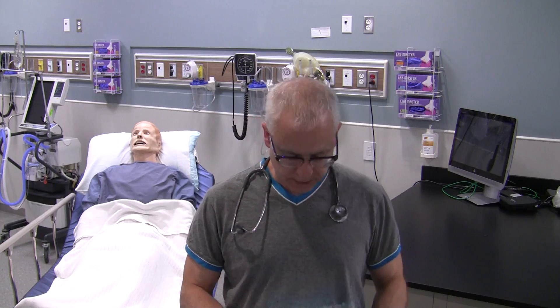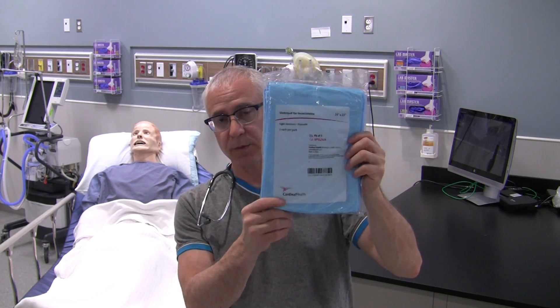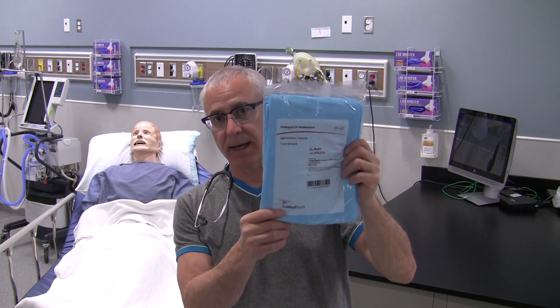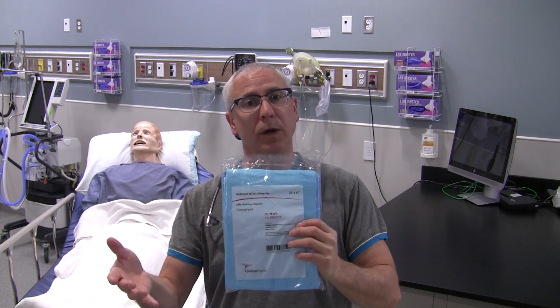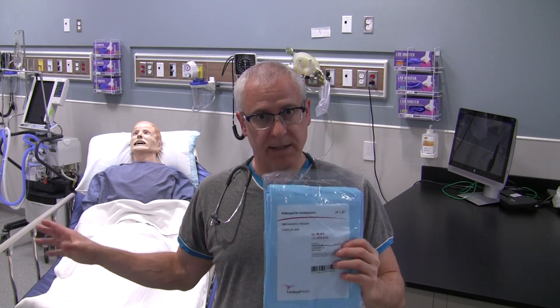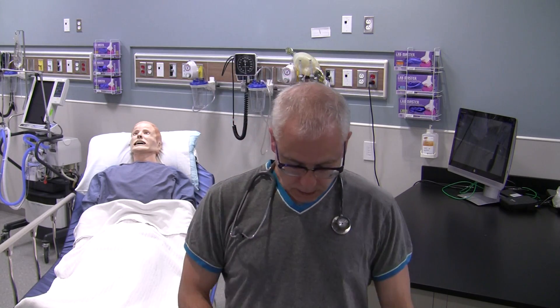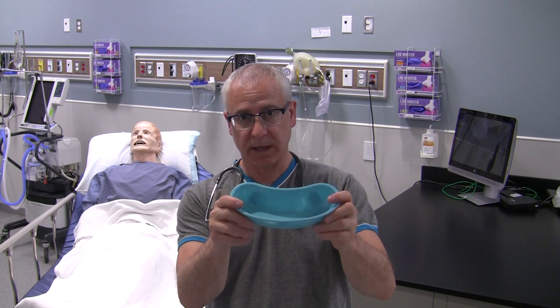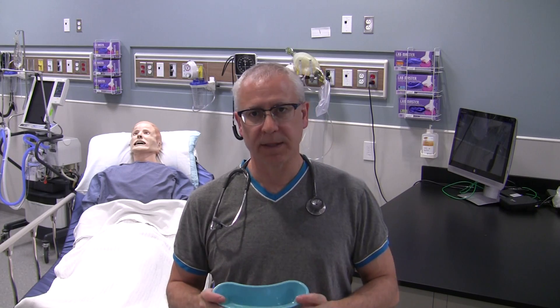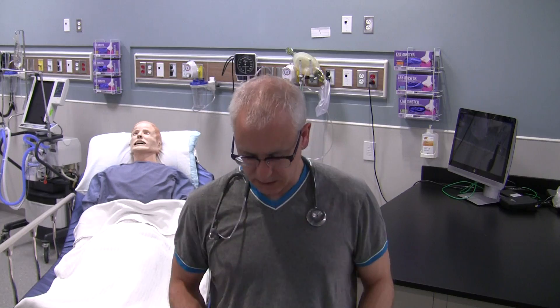For the patient, you should be using blue absorbent pads — absorbent side up — placed on the patient's chest. You can also use one to set up your equipment on a clean area. It's also a good idea to have an emesis basin or kidney basin, this size or slightly larger, just in case the patient becomes nauseous or starts to gag during the procedure and brings up secretions from their stomach. Have a collection receptacle ready for that.